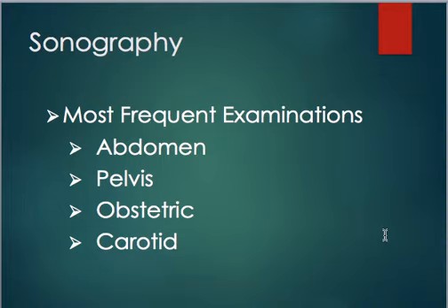The most frequent exams for sonography are going to be abdominal, pelvic, obstetric, or OB, for the fetus, and the carotid artery in the neck. Those are the 4 most frequent exams in sonography.